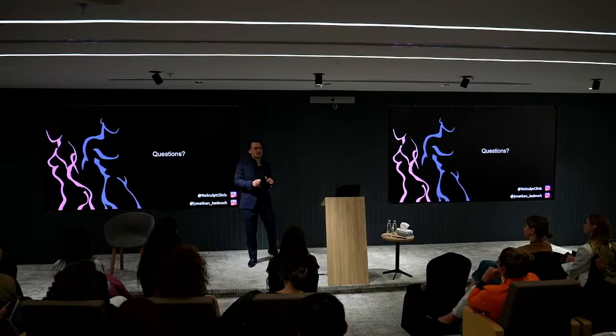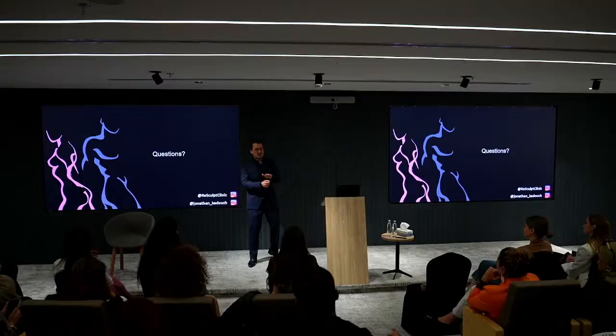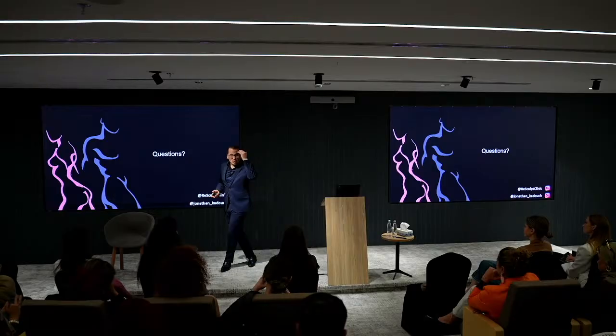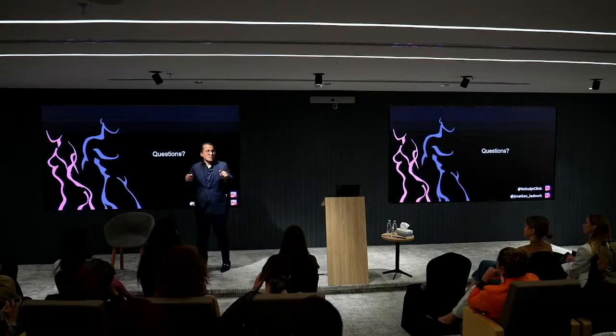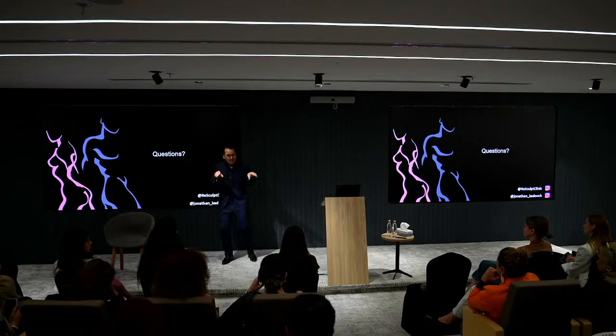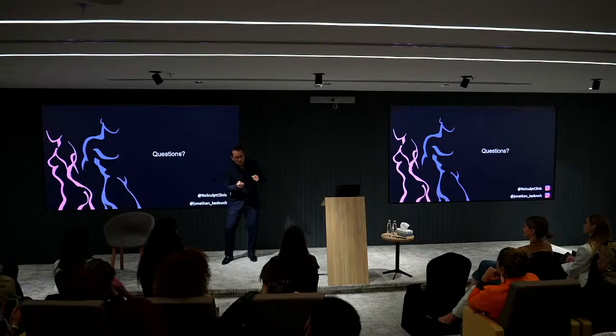Because then the patient will be uncomfortable. But the moment that you can find a way around the resistances, it's less painful for the patient. And because you have a good bony structure, you can still have an even result because you can massage it all the way. So you don't have to put the product everywhere exactly the same. You can just go around it, put it at some hot spots here and there, give a bit extra. You will make irregularities, but then you massage it away.